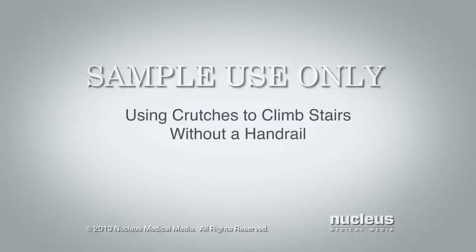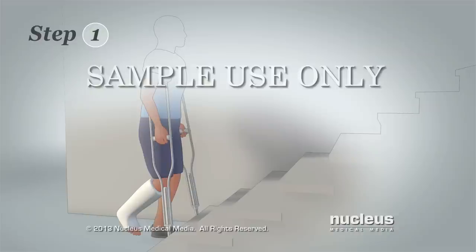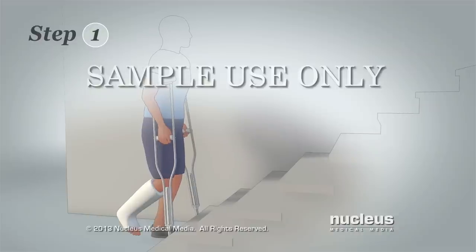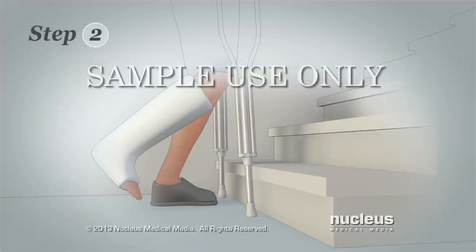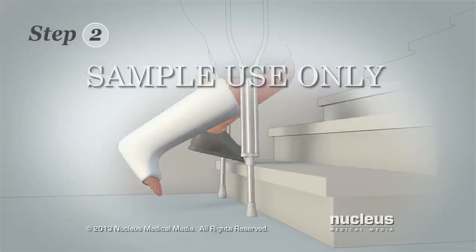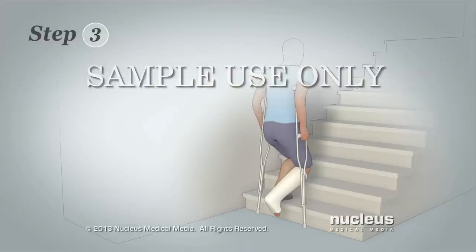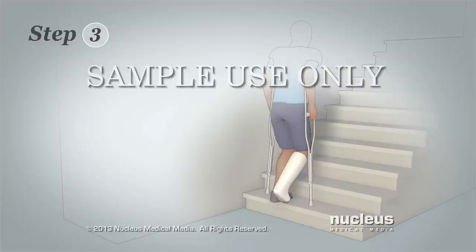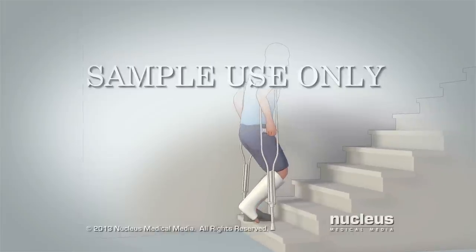You may also need to climb stairs that don't have a handrail. Step 1: Begin as close to the stairs as possible. Keep one crutch under each arm and lean your weight on the hand grips of your crutches. Step 2: Use your uninjured leg to step or hop up onto the next stair step. Step 3: Pull your crutches up with you onto the step. Repeat this process for each stair step.